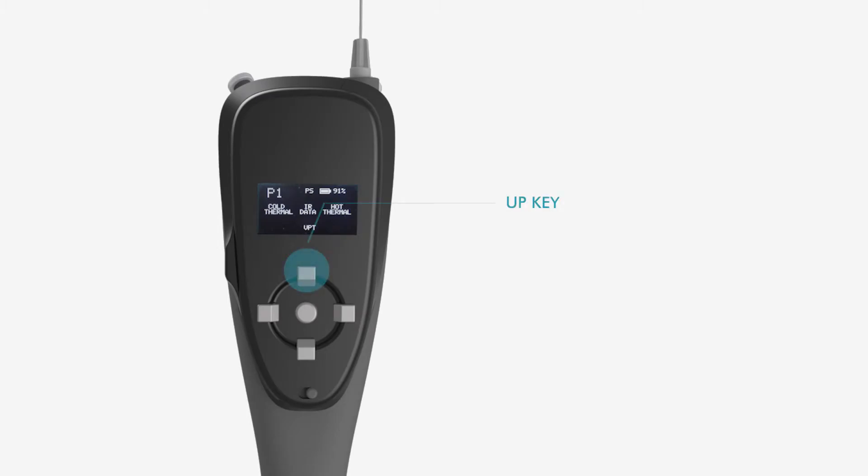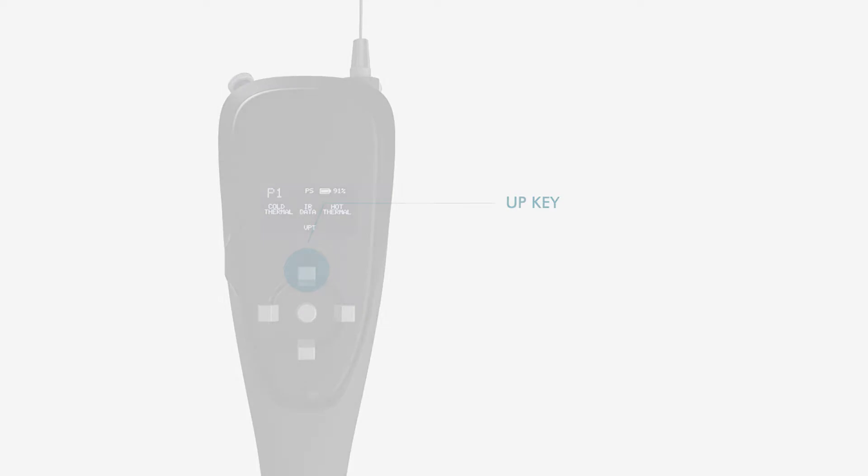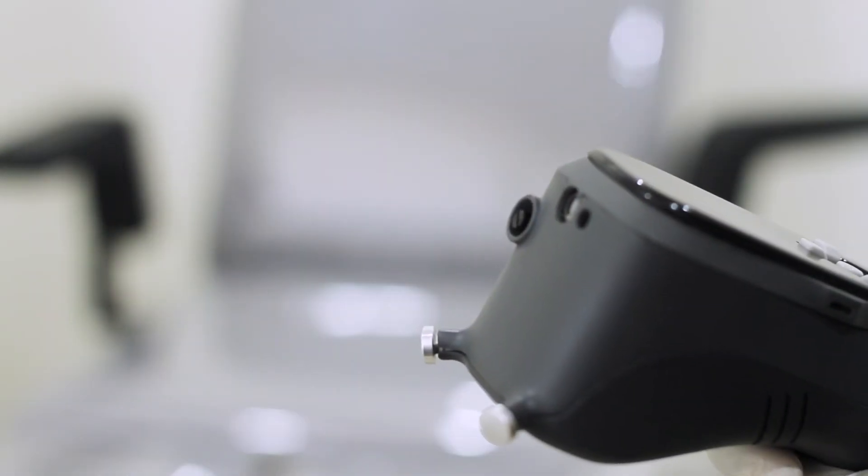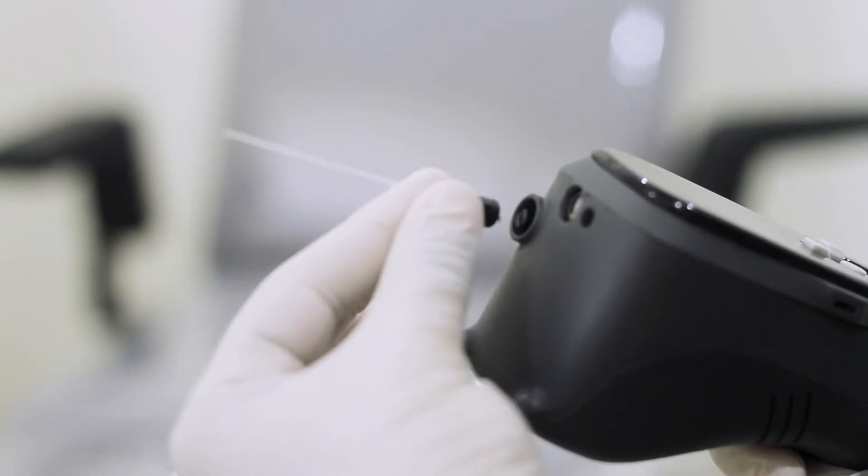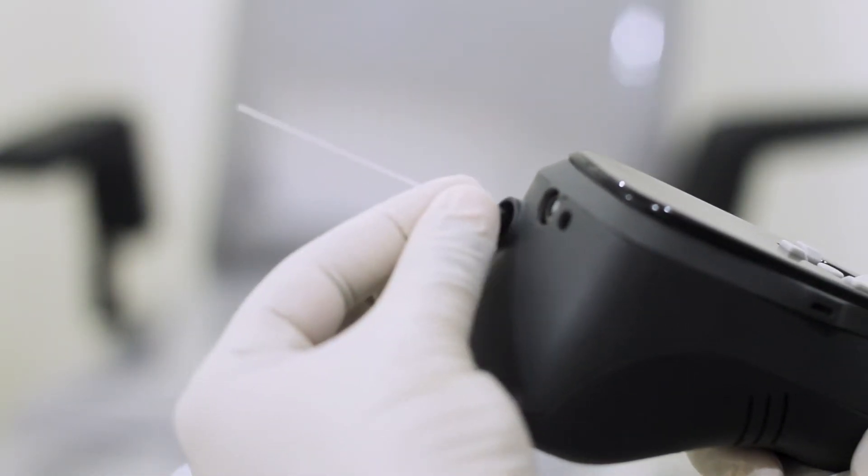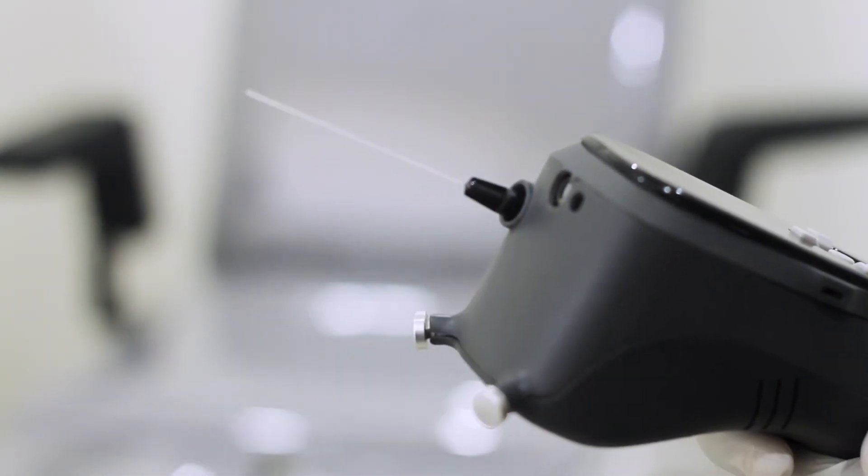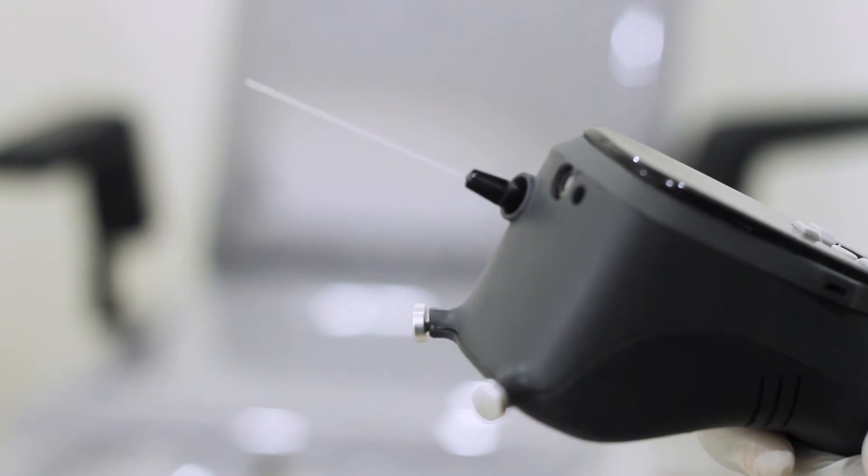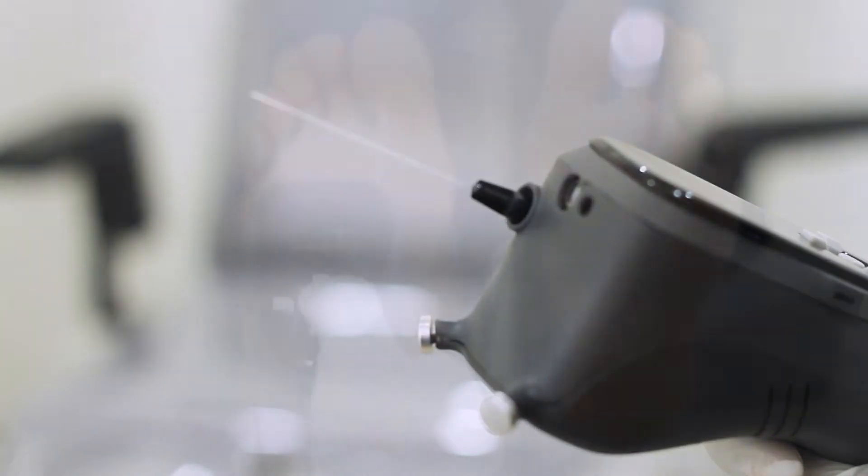Press the up key to select Protective Sensation Test. Place the monofilament into the monofilament base and gently push till it tightly fits.